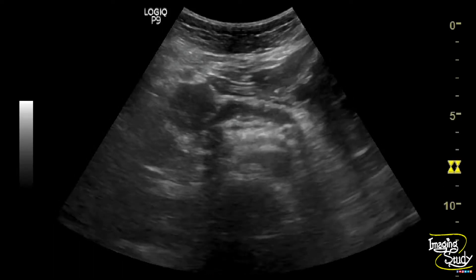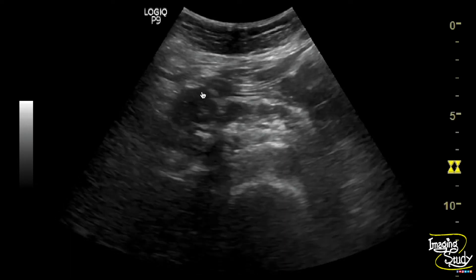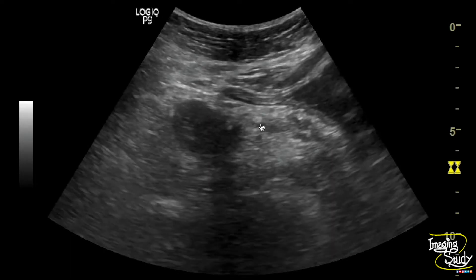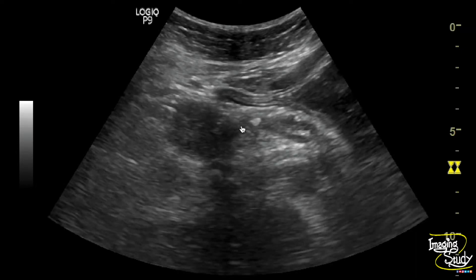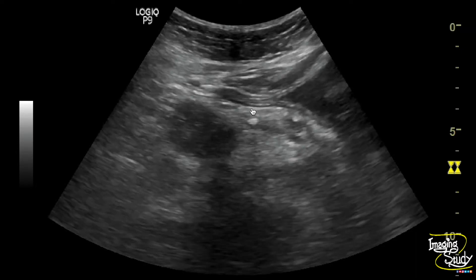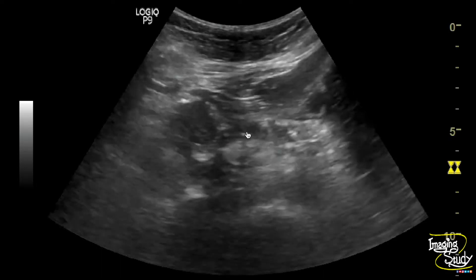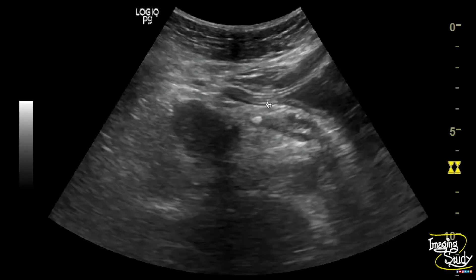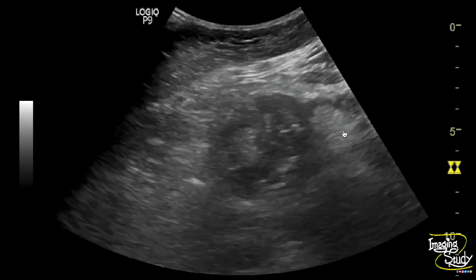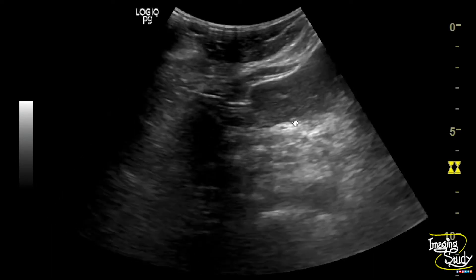You can see the pancreatic region, and there is a hypoechoic mass at the head of the pancreas. You can also see a tiny hyperechogenic structure within the lumen of the main pancreatic duct. Looking carefully, there is another hyperechogenic structure, and the pancreas overall is thin, hyperechogenic, and irregular with multiple tiny hyperechogenic structures at the parenchyma.